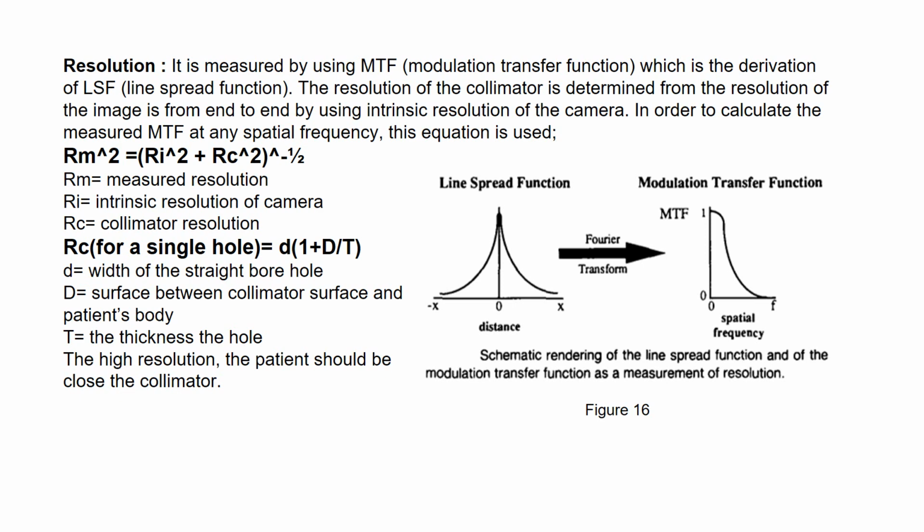The resolution depends on the width of the straight bore hole, the distance between the collimator surface and the patient's body, and the thickness of the hole. For high resolution, patients should be close to the collimator.